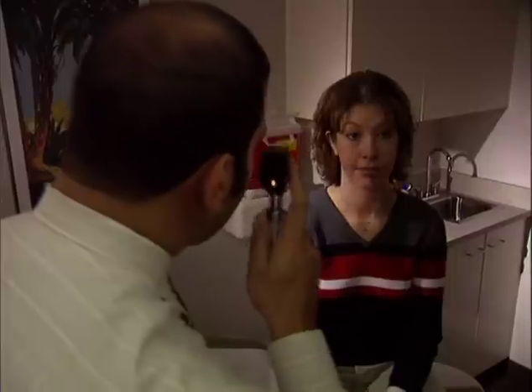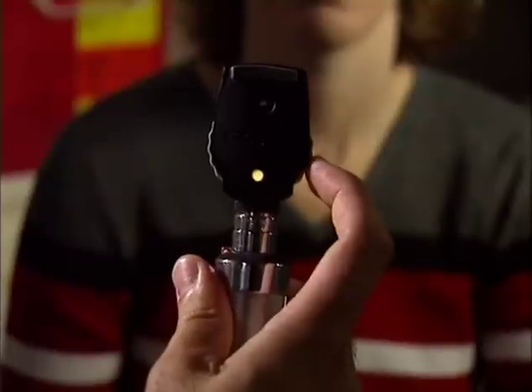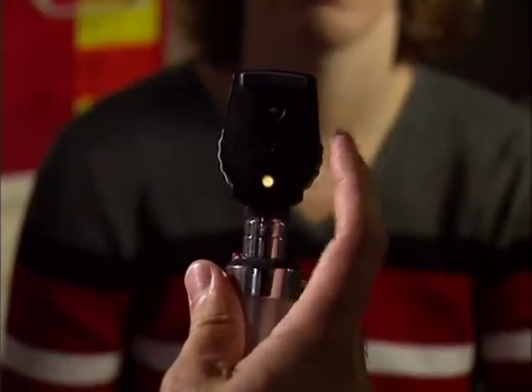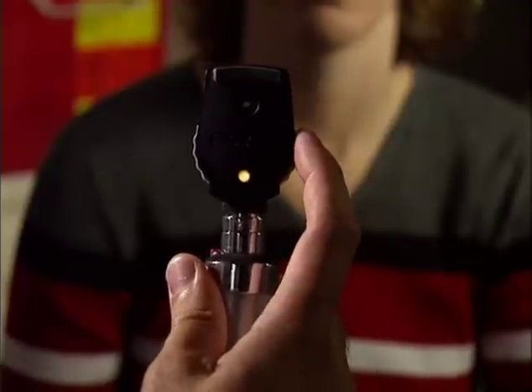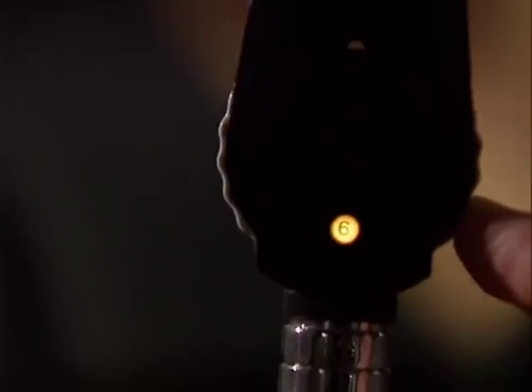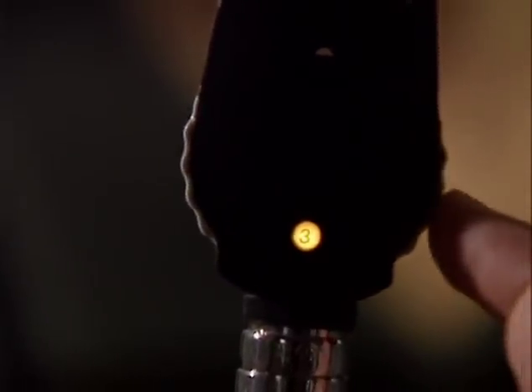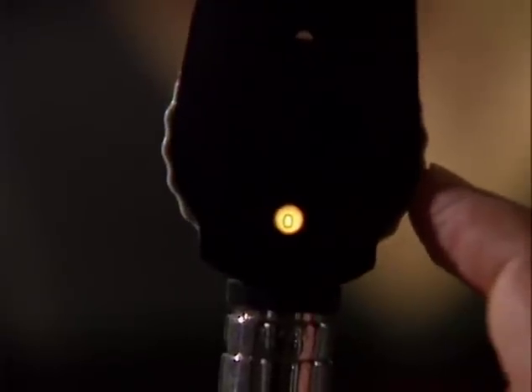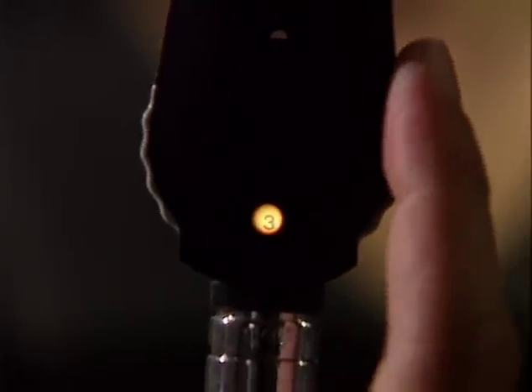If you're examining the patient's right eye, you should hold the direct ophthalmoscope in your right hand and look with your right eye. You should use your left eye when looking at the patient's left eye. If you or the patient or both have refractive errors, you need to adjust the dioptric power of the ophthalmoscope. The ophthalmoscope will have two sets of numbers, usually red and black or green. The black or green numbers signify plus power to correct for farsightedness, hyperopia, and the red numbers represent minus power to correct for nearsightedness, myopia.